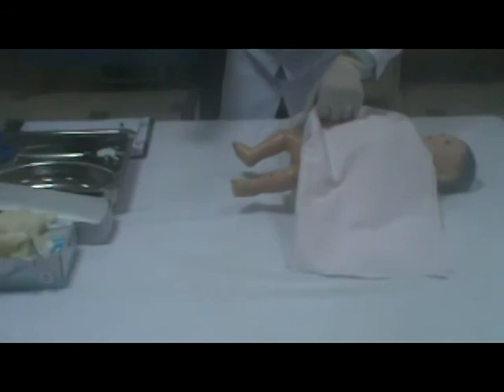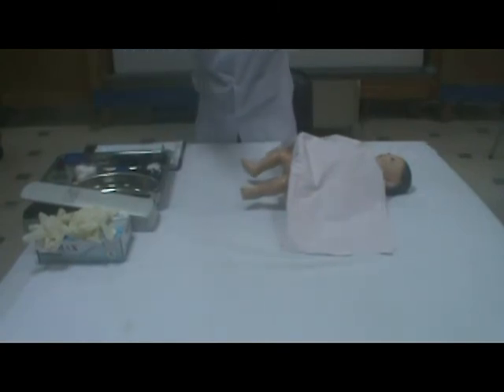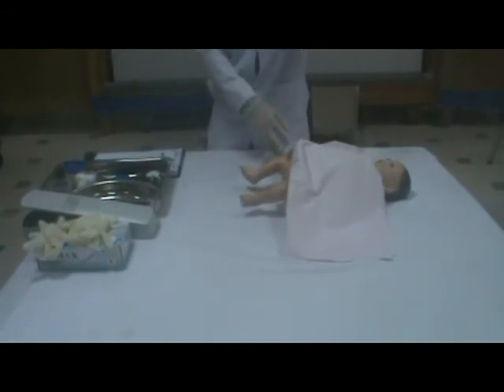Remove the thermometer and wipe it with a dry cotton swab. Read the thermometer reading. Record the temperature.